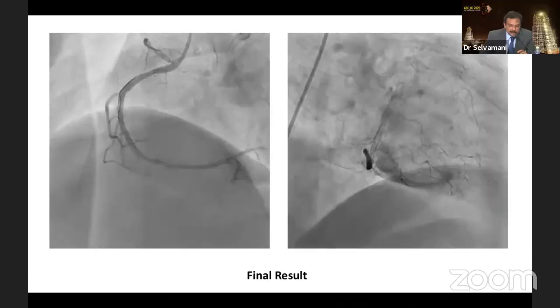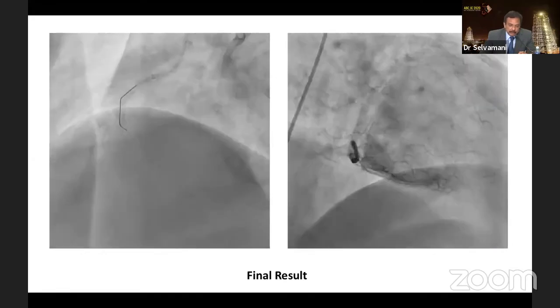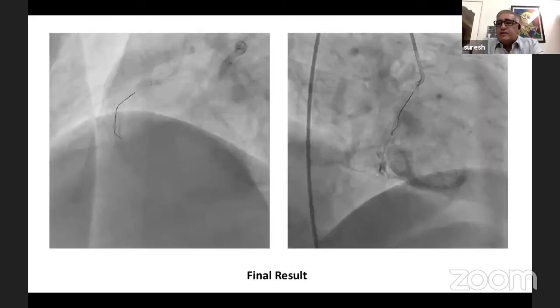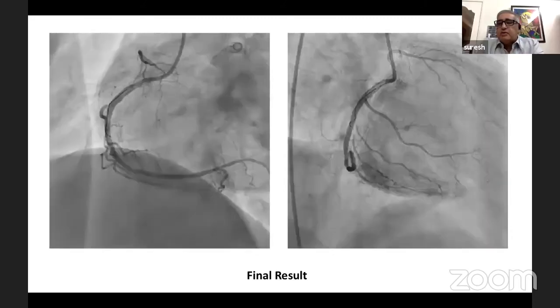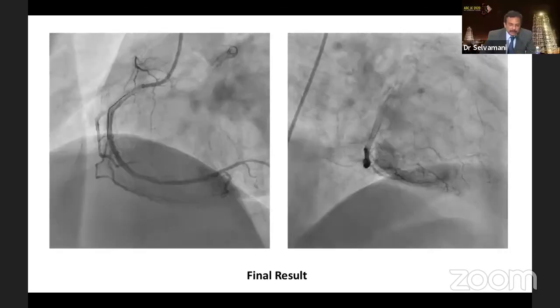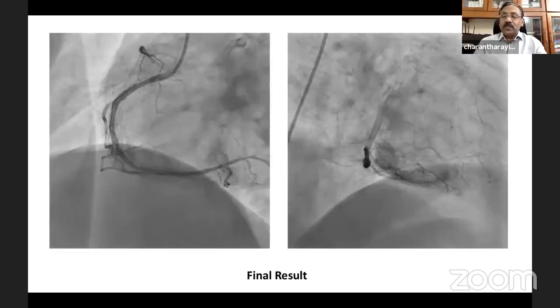Yeah, but after putting a second stent, even if you dilate with a bigger balloon, I have seen that it doesn't expand. That sandwich thing, I mean, I didn't see that much. Yeah. I think whatever expansion you could get had to come with the first preparation. That's right. Absolutely. Dr. Suresh, I agree with you.